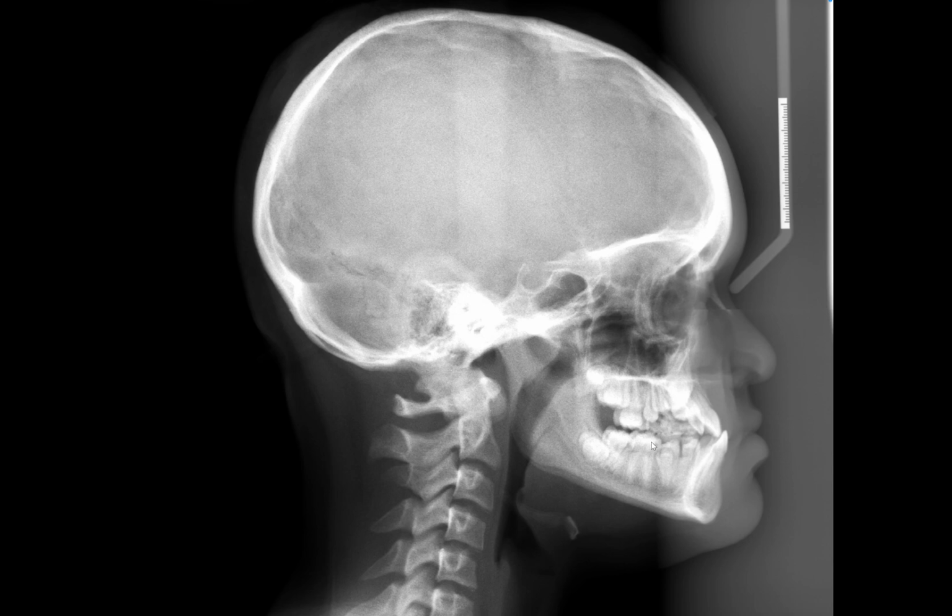But what if you can have a perfectly symmetric face, near perfect? Even then, you would still not be able to have a perfect alignment of the right and left side. So why is that the case? In order to answer that question, you have to understand the geometry a little bit. You have to know where the source of the radiation is and where the patient is located, and the location of the imaging medium, whether it's a sensor or film, phosphor plate, whatever that may be.